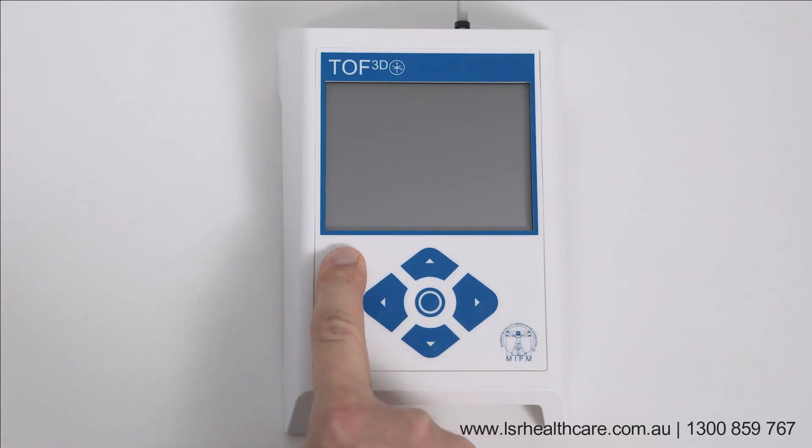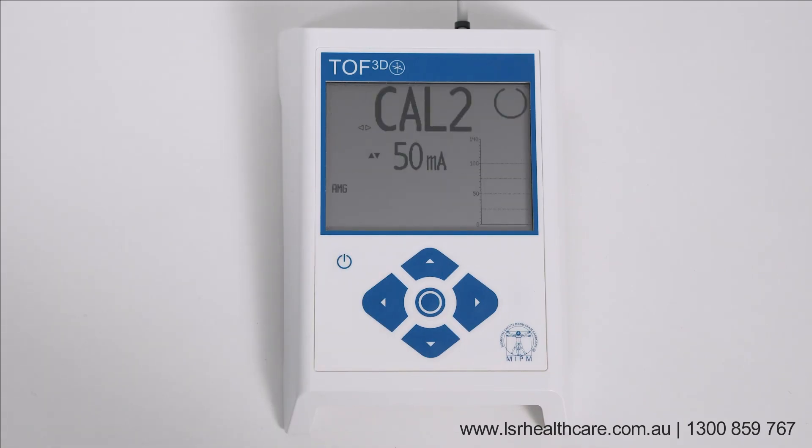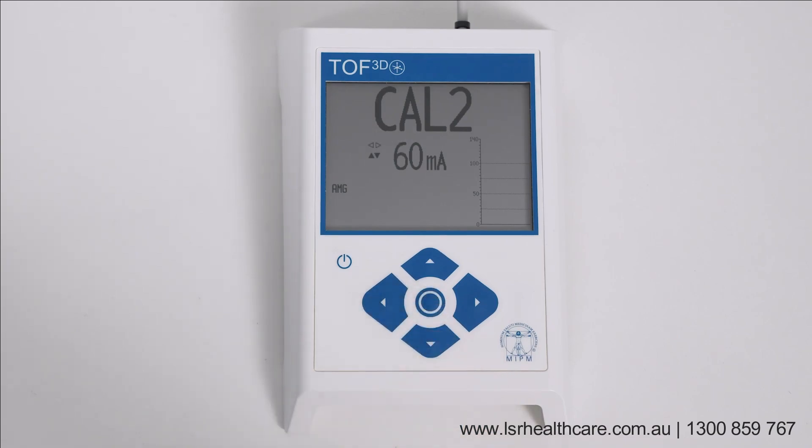Turn on the unit by holding the ON-OFF button for one second. Calibrate the monitor by pressing the center key for one second. After successful calibration, a triangle is displayed in the lower right side of the display.